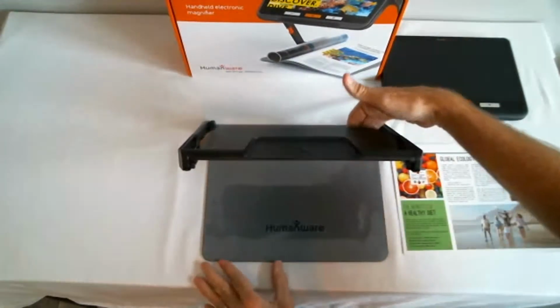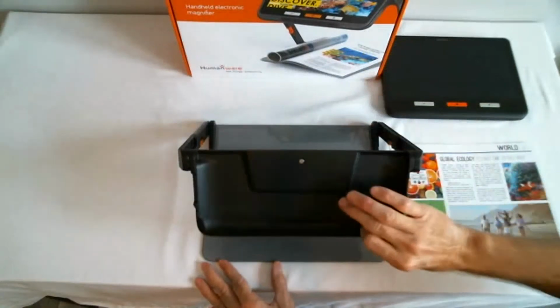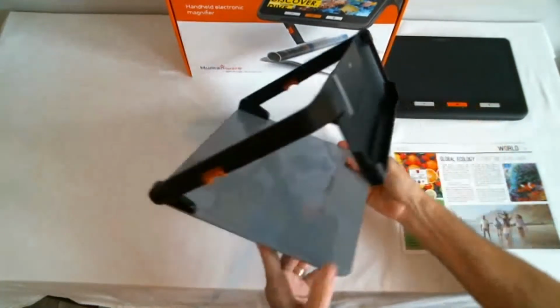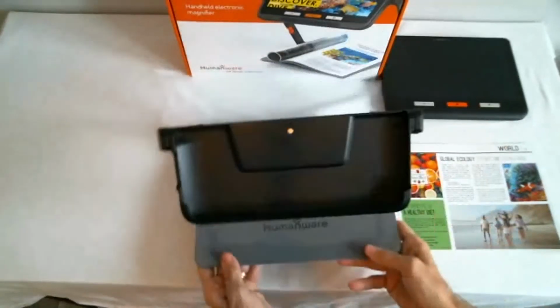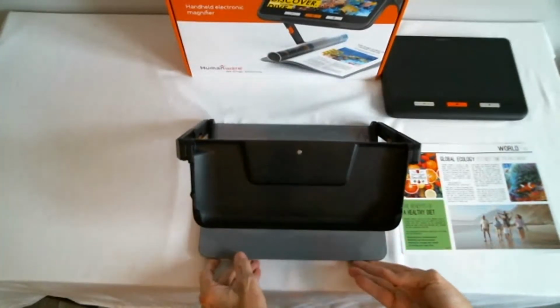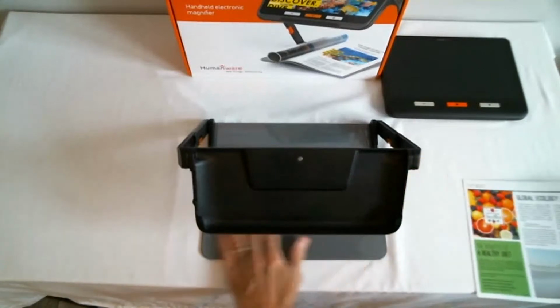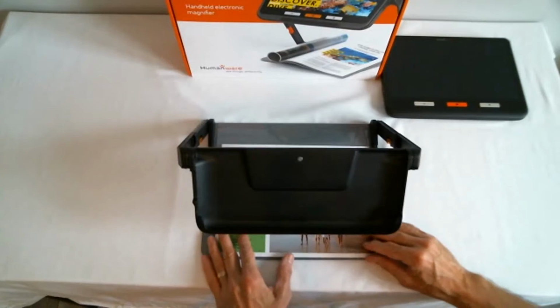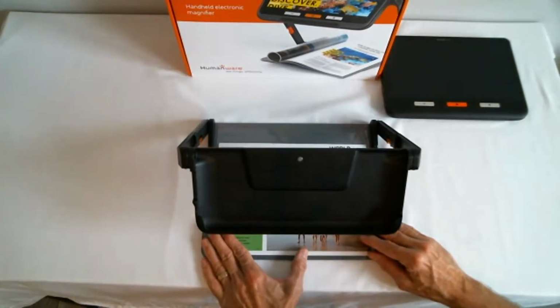I can lift the device tray up and rotate it over so that it's in its fully open position. I'll again show you the side so you can see what that looks like when it's in its open position. And at this point, there's actually a clear plastic over the top of my document tray that I can remove if I was going to be using this full time.